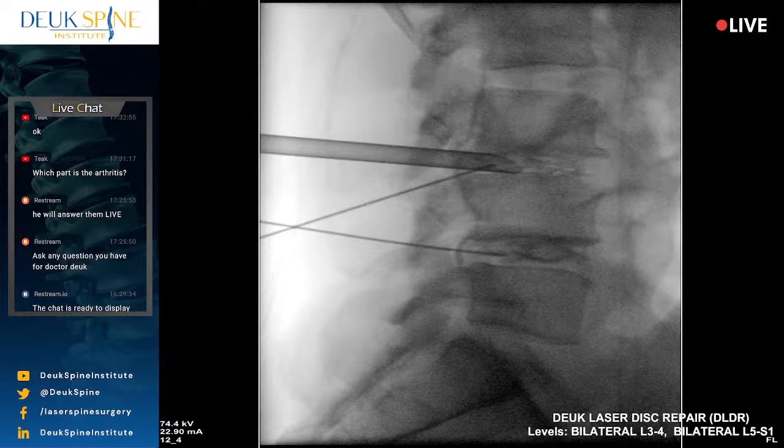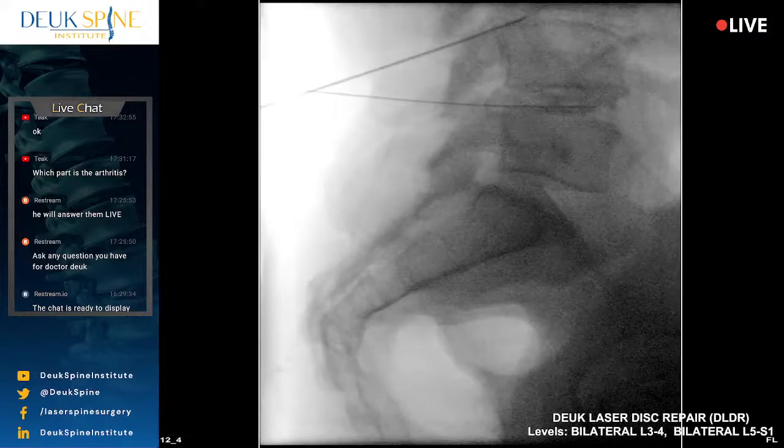All right, give me a lateral view. We need that fluoro on the facility. Need you guys to keep up with us. Where's my fluoro shot? I need the fluoro up there. Who's in charge? Come on, Rita. There it is. Somehow it's working.